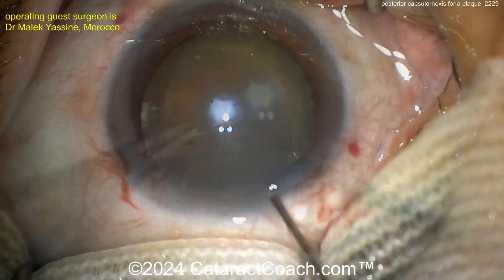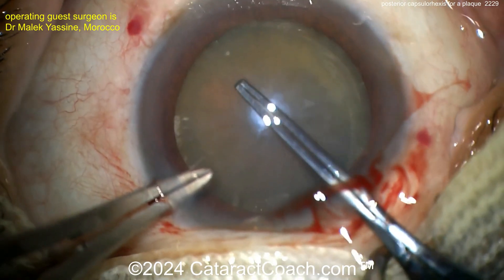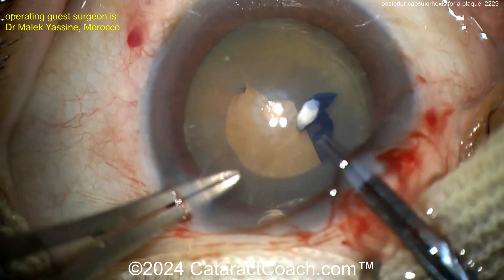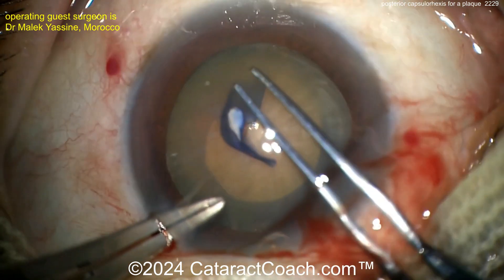Here you can see the patient has a relatively dense cataract, very opaque. Getting that rexis done. The guest surgeon here is going to do a beautiful job of that rexis. Using the left hand to fixate the eye and hold it still through the paracentesis, the right hand is doing a very nice looking capsule rexis.